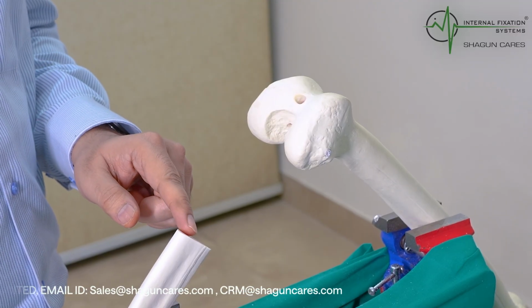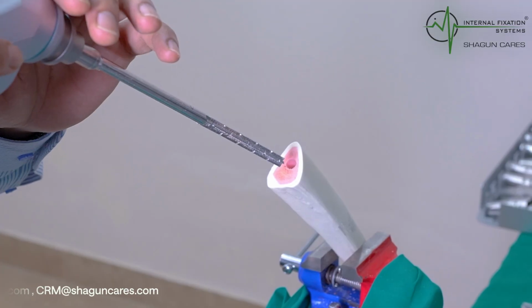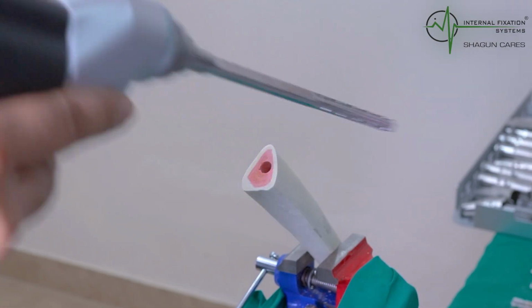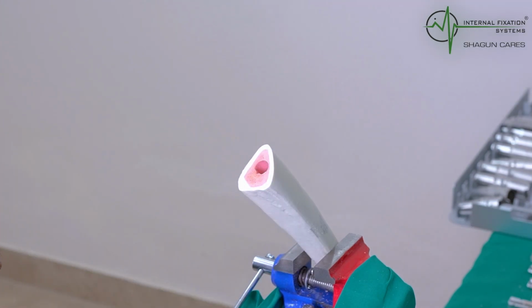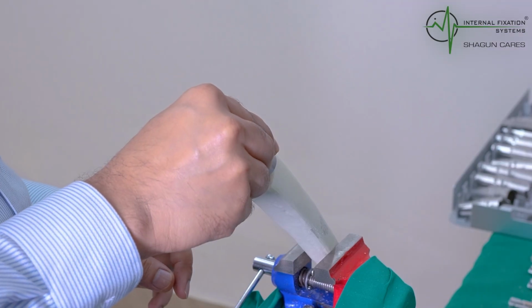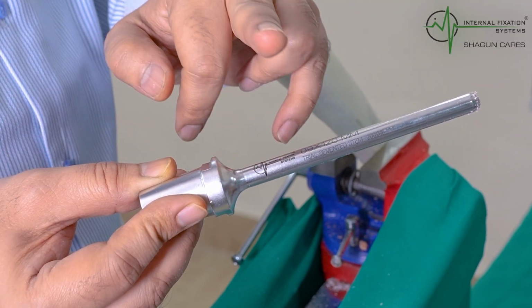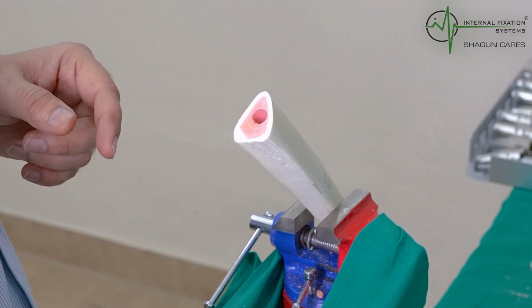Now you need to ream this side. Once we have cut this, we are going to enter and ream the canal. You need to check after reaming that this is going inside. So yes, it fits well. Now if you focus here, this is a beveled edge. It's not a straight edge, it's a beveled edge. So you need to prepare this canal for this beveling.